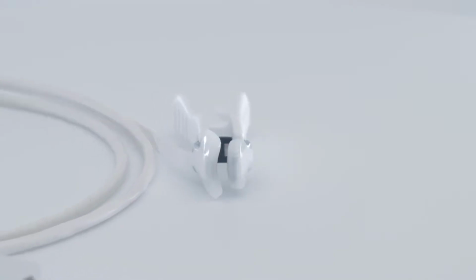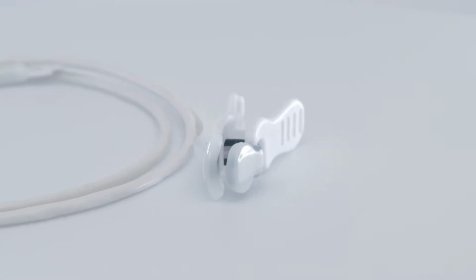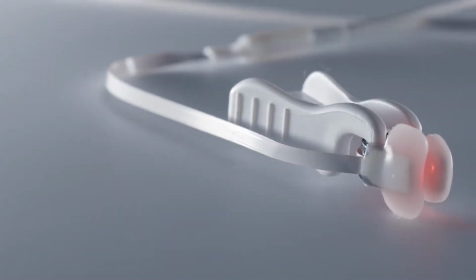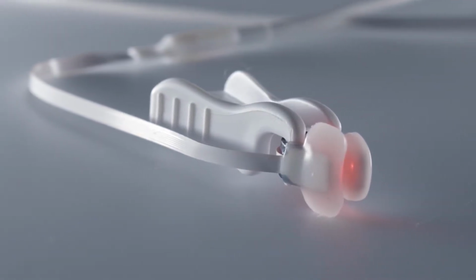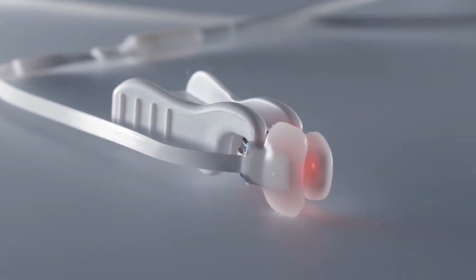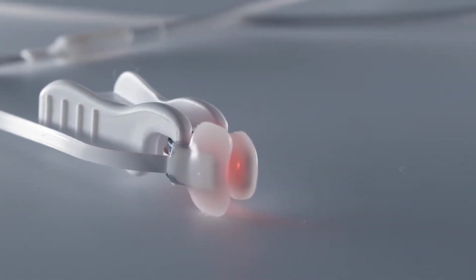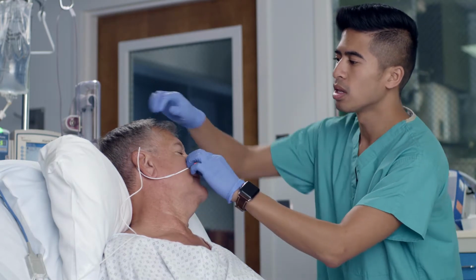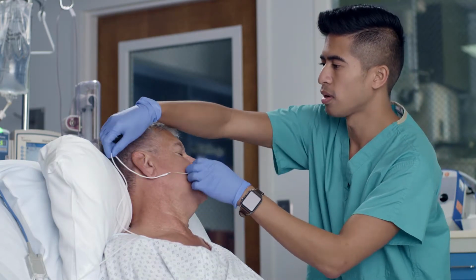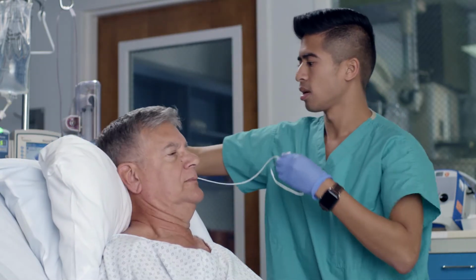The durable clip and medical-grade silicone pads are designed to be reapplied multiple times. The Alar sensor does not use adhesives and the LEDs emit very little heat. This, combined with protocols for consistent site check and rotation, can support a skin-safe protocol. Following initial application, the Alar sensor should be repositioned to the alternate ala at least every 8 hours, checking the skin at the application site at 4 hours.